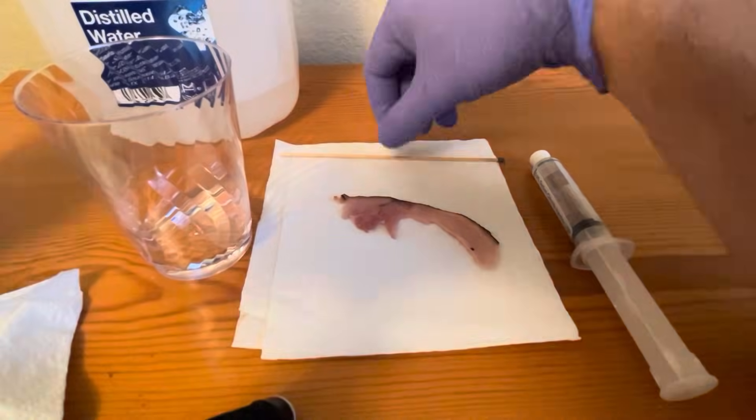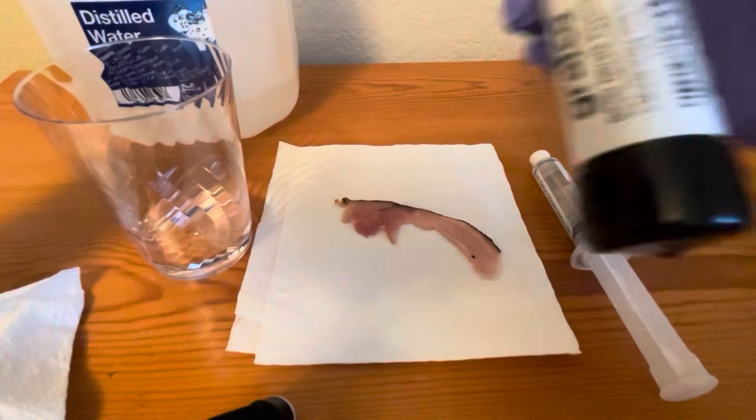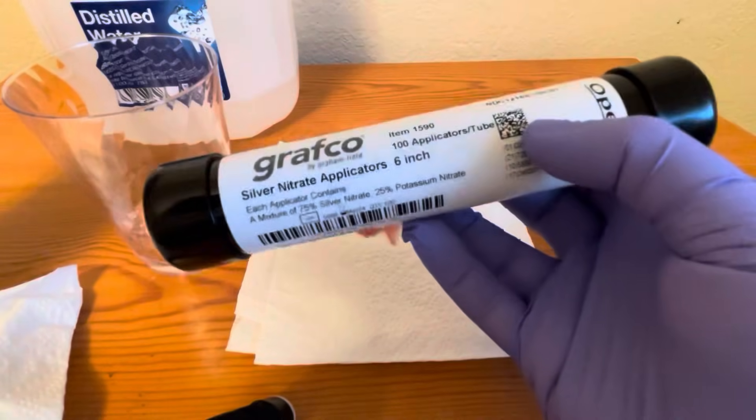How to use silver nitrate on granulated tissues and for removing warts — but this is mostly for granulated tissues that are hyper-granulated. You get your silver nitrate applicator sticks.